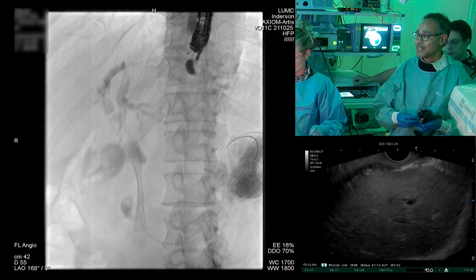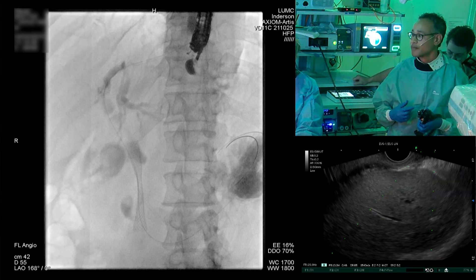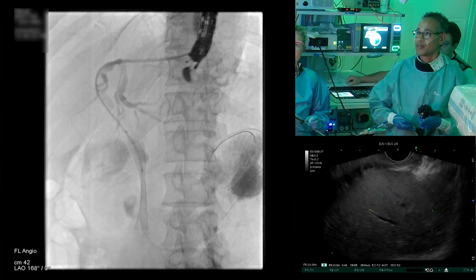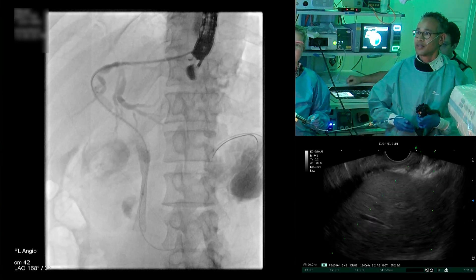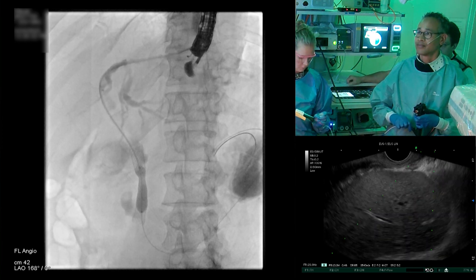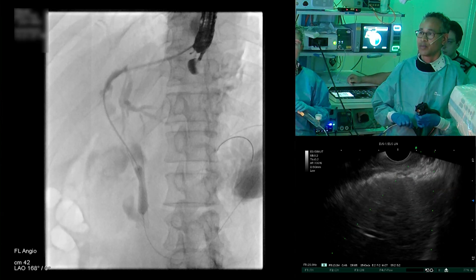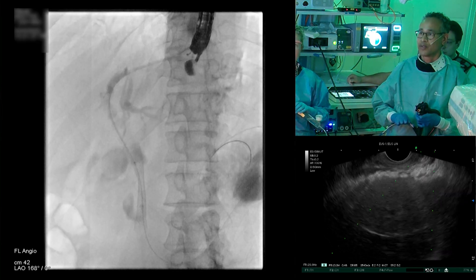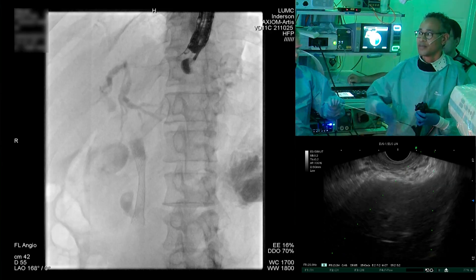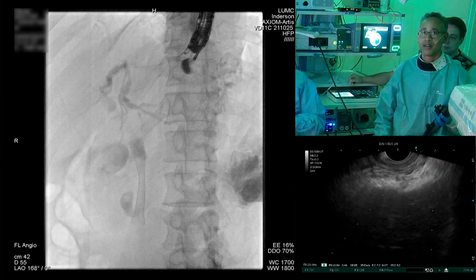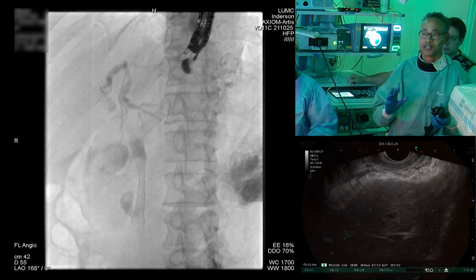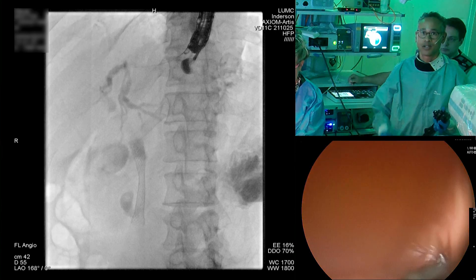We're going to post-dilate the stent with the 10mm dilation balloon we used before. Introduction of the dilation balloon — you see the contrast already flowing out of the intrahepatic bile ducts. Try not to dislocate the stent, but this seems to be right in position. Make sure we fully deflate the balloon before pulling back, so as not to dislocate the stent. We're going to remove the stent system. We don't need to do anything with the 2mm hole we made in the liver, because we had about three centimeters of parenchyma traversed — this will close. You don't need to place pigtails or a metal stent in this case, because we have adequate drainage.